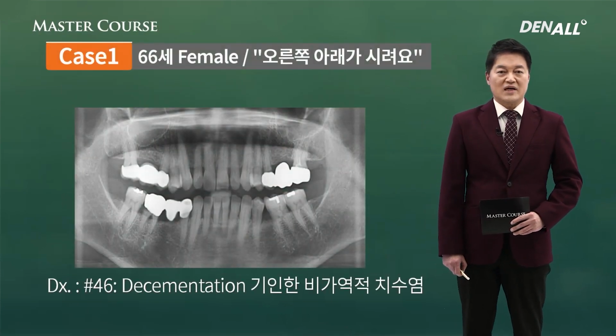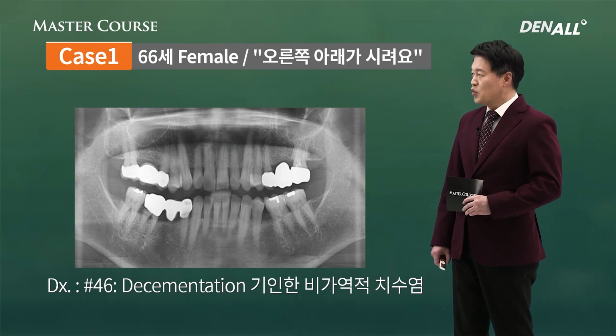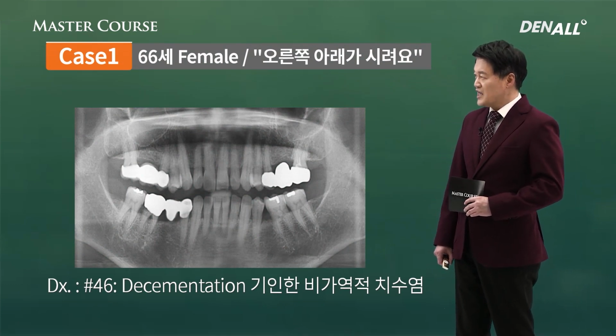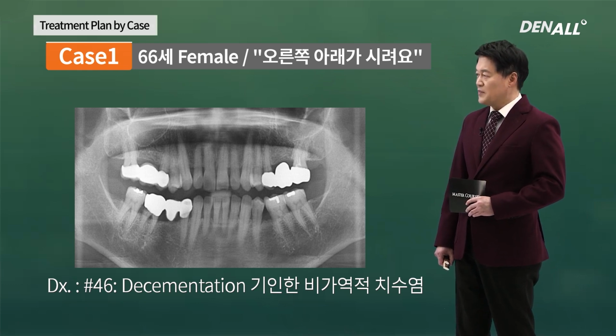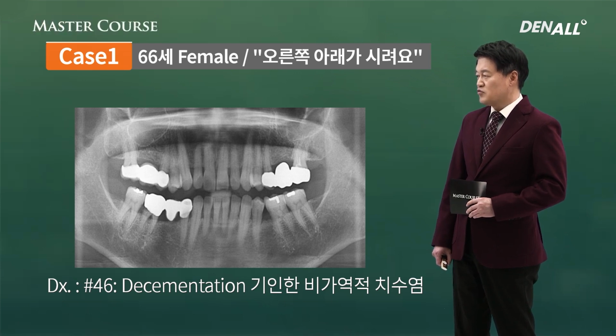Let's look at the first case. A 66 year old female patient. She complained of discomfort in the lower right. As you can see on the X-ray, in the 3 unit bridge on number 46, there was irreversible pulpitis due to decementation.